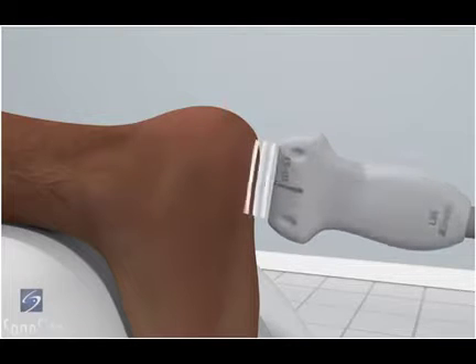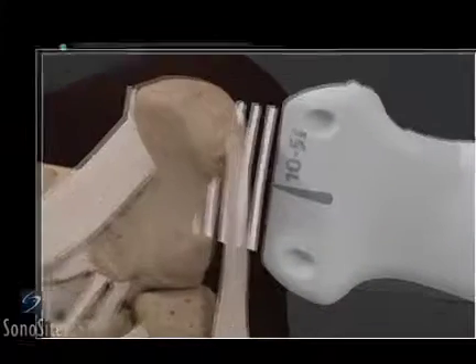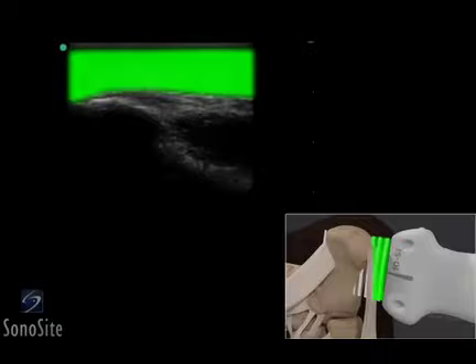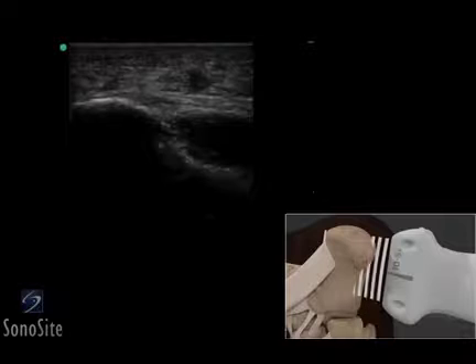The transducer is placed over the sole of the foot in a longitudinal fashion with the orientation marker directed toward the patient's head. The thick sole of the foot can be seen as a complex patterned structure immediately below the surface of the skin, overlying the calcaneus, which appears as a bright, hyperechoic structure.